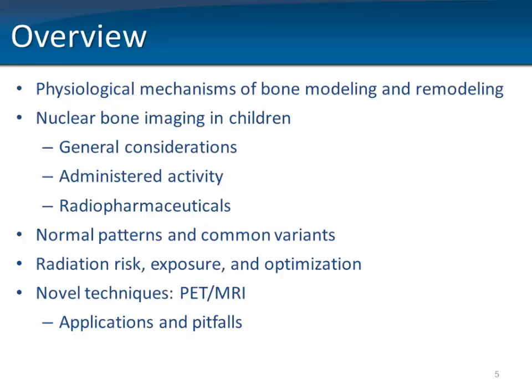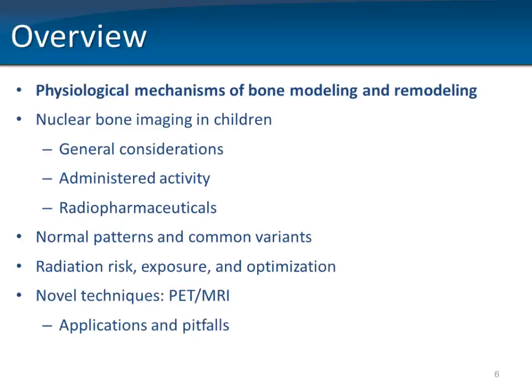Novel techniques, I believe PET-MR is upcoming. However, applications are still limited, and a number of pitfalls really merit mentioning, because we have come a long way, but there are still a number of challenges we have to tackle.